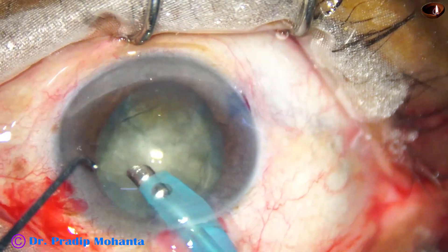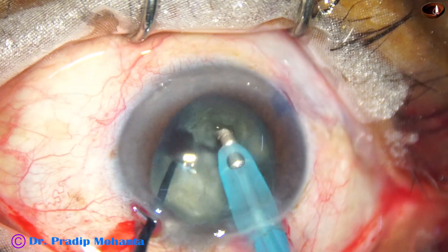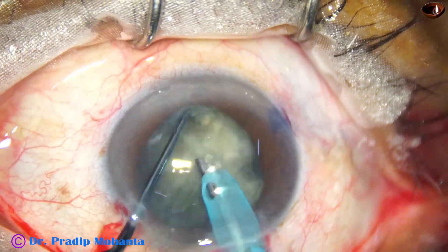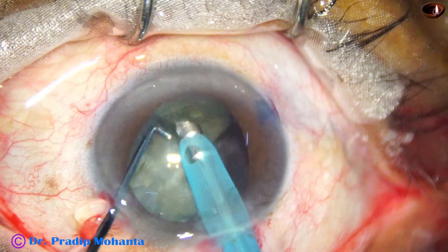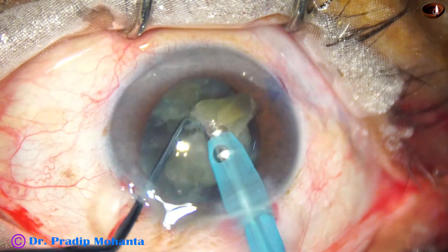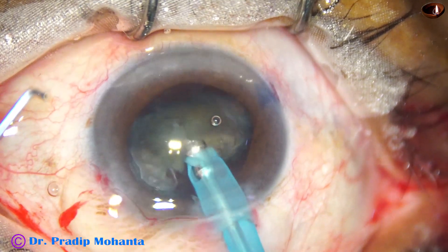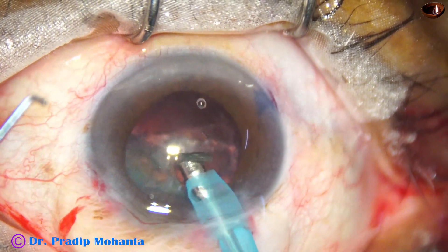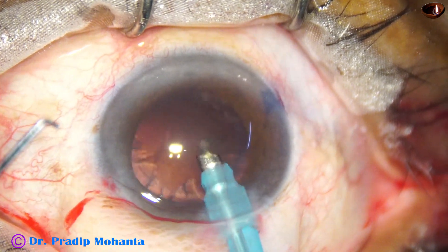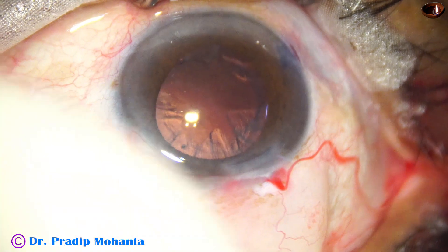The phaco handpiece goes in and I am trying to get a free nuclear fragment. Yes — I start emulsifying the free nuclear fragment, rotate, and get another free nuclear fragment. Ultrasonic energy used is about 60 percent, flow rate is 48 ml per minute, and vacuum is 480 millimeters of mercury. The management of the nucleus has been easy because of this pre-chopping of the nucleus.